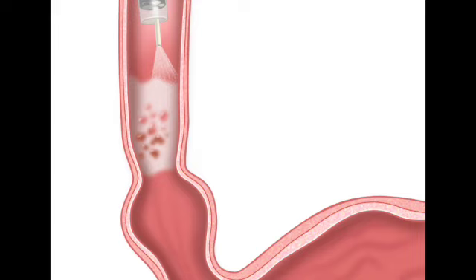No, definitely not. They don't just pour a bottle of acid into the digestive tract. It is a highly controlled, localized delivery system. What does that look like? Well, the doctors use a specific setup consisting of a spray catheter, which is a very long, very thin tube designed to deliver a really fine mist.